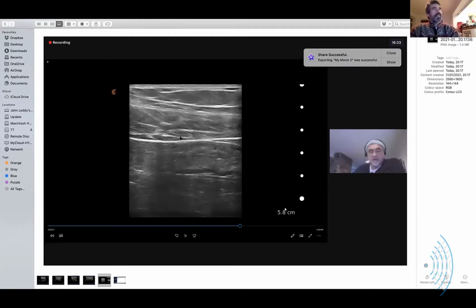Yes. Okay, so you were dead right about fat, abdominal wall. This is the peritoneal cavity. So this is where all your guts are. And this is a long section of bowel, with this being the bowel wall, and this is poo.